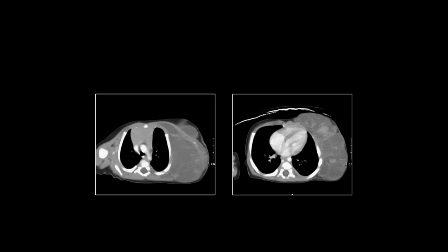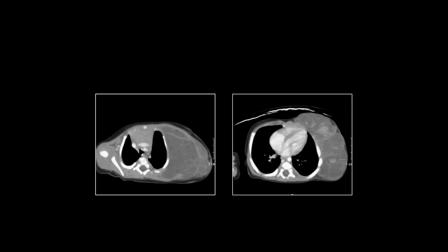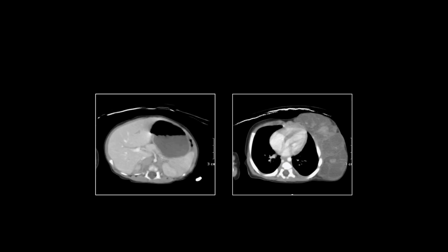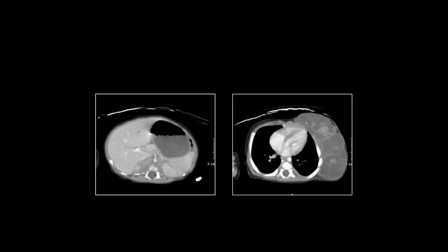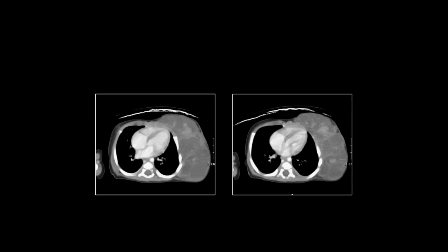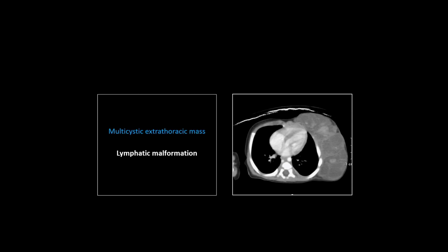So as a hint, you can see this one actually goes up into the cervical region, and that's actually the most common location to see this lesion. They usually start in the neck and progress down into the thorax or just involve the neck. So this one is a little unusual in that the bulk of it is extrathoracic instead of cervical, but it's still clearly got a cervical component. So it's mostly cystic with a few soft tissue elements, and it's entirely extrathoracic slash paraspinous cervical. That is a cystic hygroma, and you're speaking my old guy language because now they call it a congenital lymphatic malformation. But I was raised on cystic hygroma.